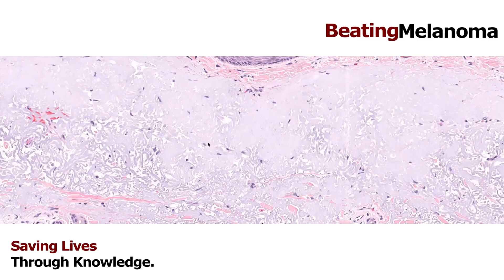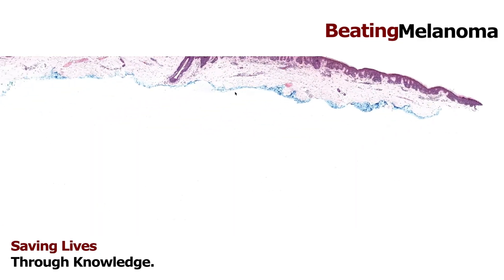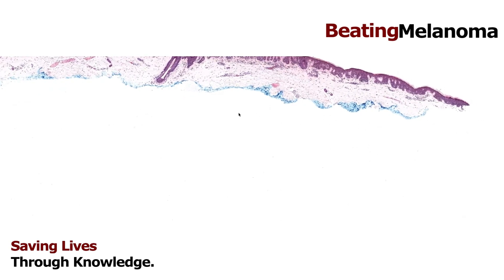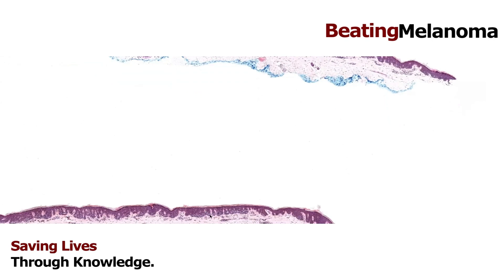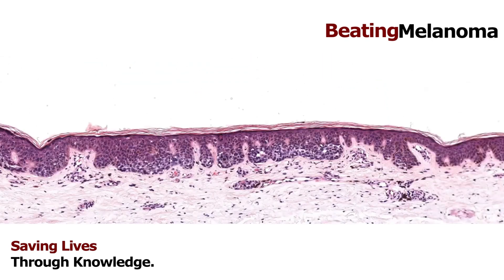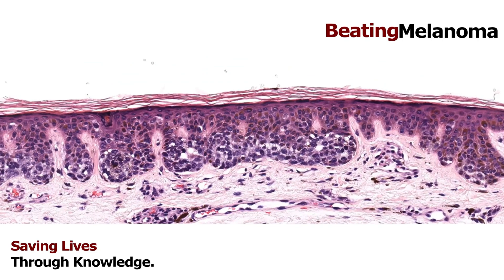Let's look at a melanoma. So here we have a biopsy — this was a shave biopsy. The dermatologist has scooped out a little bit of skin with a blade. We cut it in half, embedded both halves on end, and sliced the slide. Looking from top to bottom, you can see the difference: there are little round clusters of grayish cells — these are melanocytes, clustered together into what we call a nest.